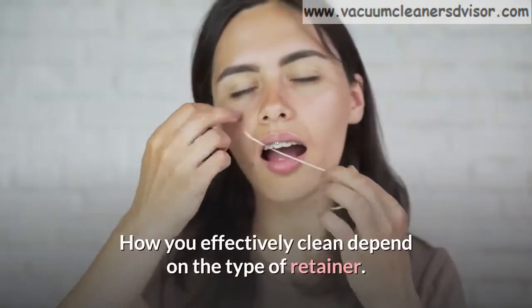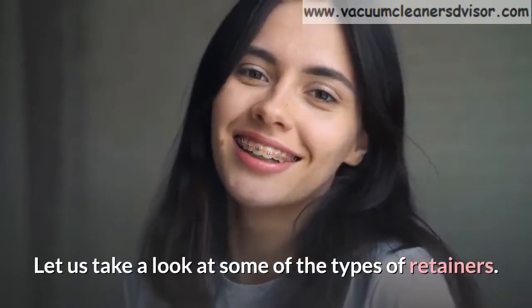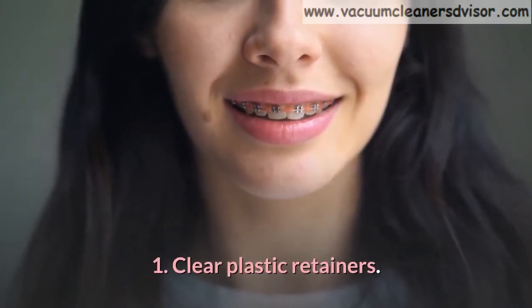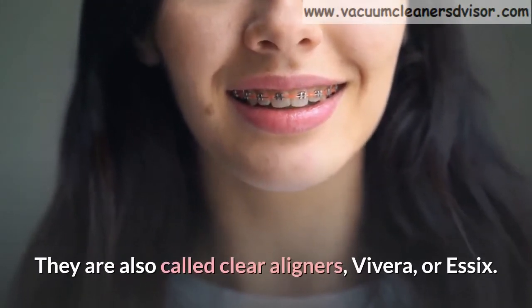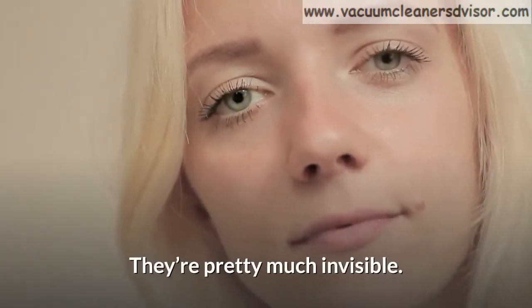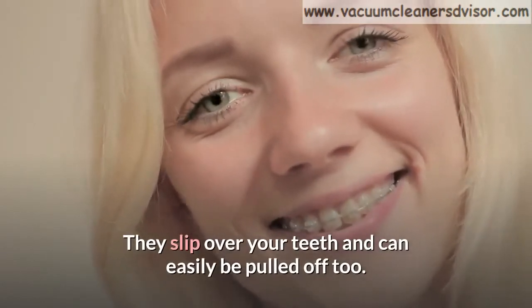How you effectively clean depends on the type of retainer. Let us take a look at some of the types of retainers. Number 1: Clear plastic retainers. They are also called clear aligners, Vivera, or Essex. They're pretty much invisible. They slip over your teeth and can easily be pulled off too.